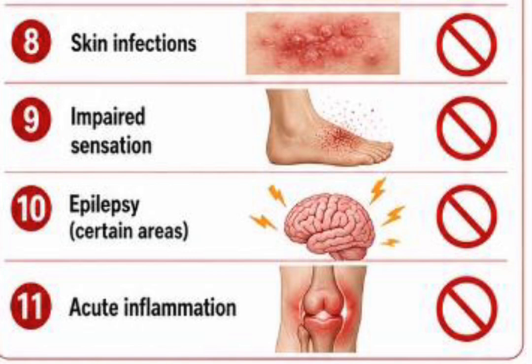Don't use it on a patient that already has epilepsy or any form of seizures, because it could stimulate the brain excessively, causing excessive neural conduction, even causing more seizures, which you cannot control because you are not qualified for it. And it could cause more neurological damage. You don't use it for patients with acute inflammation. No, don't use it, because this is not what you use for acute inflammation. You use cryotherapy. You don't use it because it could prolong the inflammation even more.